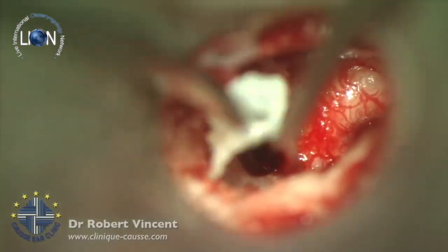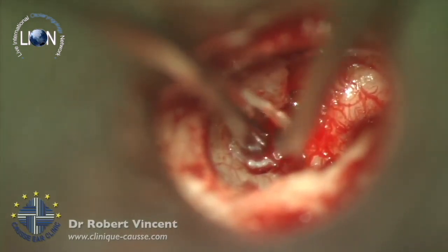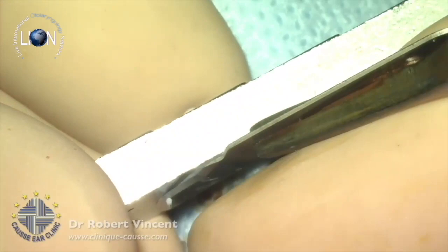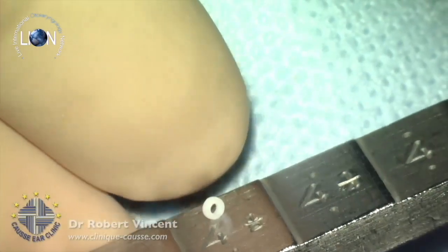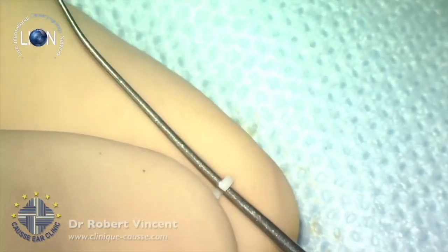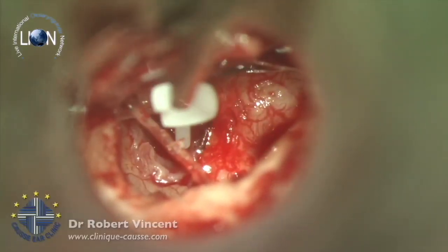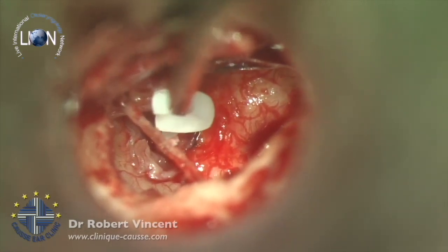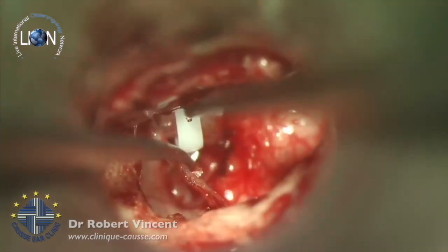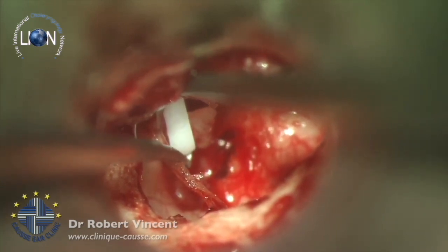I think we have time to discuss this point. Introducing the vein over the stapedotomy with the suction tube in my left hand. You notice that I'm using both hands free all the time. And then I'm cutting out this Teflon piston. I'm still using a basic one, a 0.4 millimeter diameter, breaking the memory of the loop, and then introducing the shaft first with the sucker. I'm using at that point a 0.9 millimeter diameter sucker, and then placing the loop around the incus. And then the last step will be to crimp the loop around the incus to ensure precise stability.